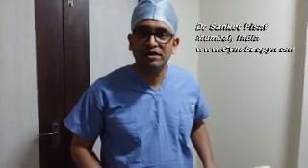After the patient has been brought into the OT, make sure you greet the patient, make her feel a little bit at ease. Take a moment again to reconfirm the identity of the patient, to reconfirm that the patient knows why she has been brought here and what surgery she is going to undergo, which will allay her fears to a great extent. Doing all these small and simple steps before starting your case will definitely make sure that you have a whole lot of safe Gynaec endoscopy coming your way.